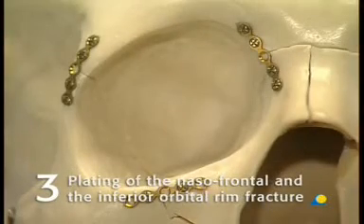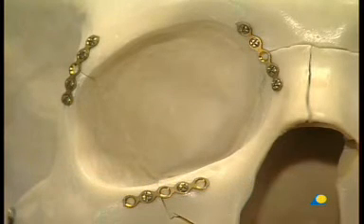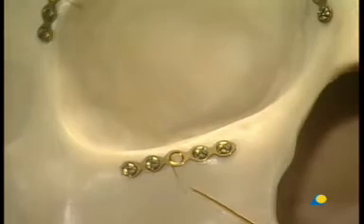Plating of the nasofrontal and the inferior orbital rim fracture. Plating of the right orbital aperture will be completed with reduction of the medial maxillary nasal segment. The nasofrontal and the inferior orbital rim fracture plating is done with 1.3 plates. A minimum of 2 screws are inserted on each side of the fractures.